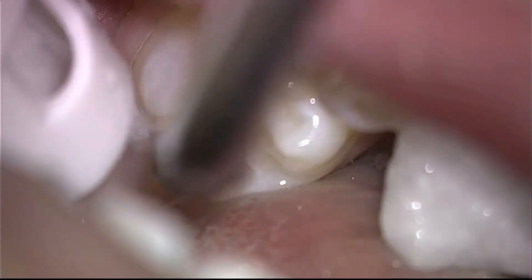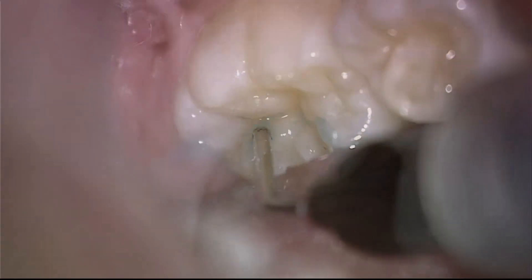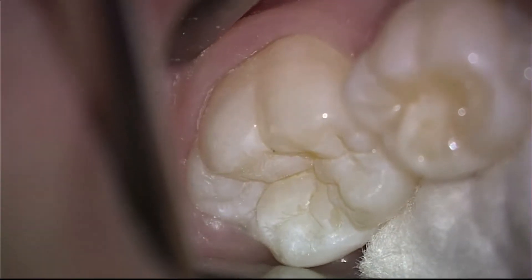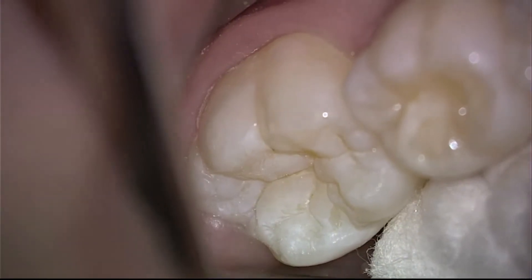So we will rinse this off and then begin the bonding process with a mild phosphoric acid. This opens up the small microtubules of the enamel. Now you can see a tooth that is incredibly well prepared for a permanent sealant — a super sealant.